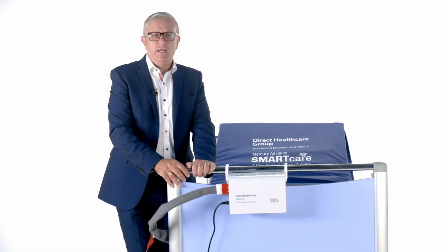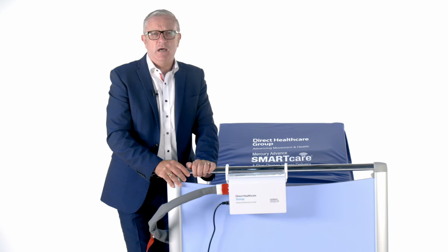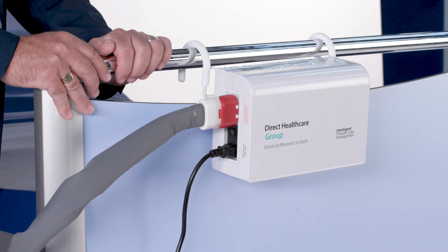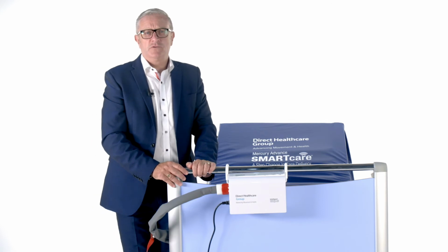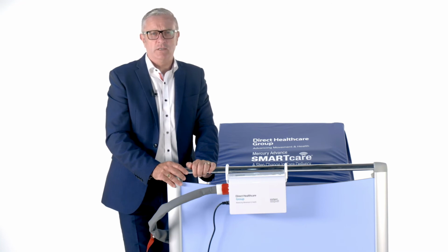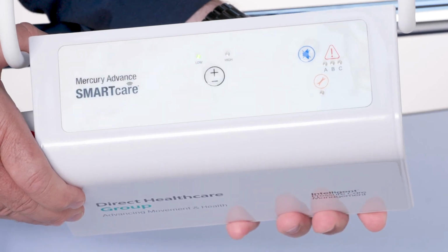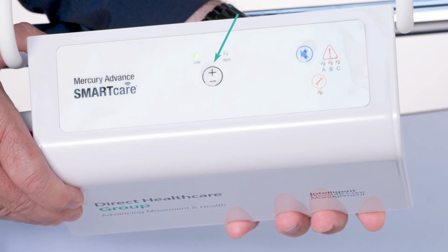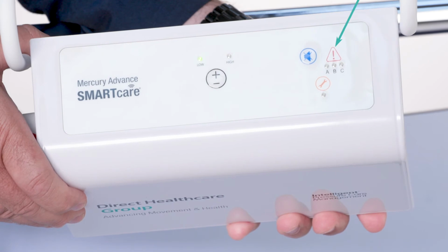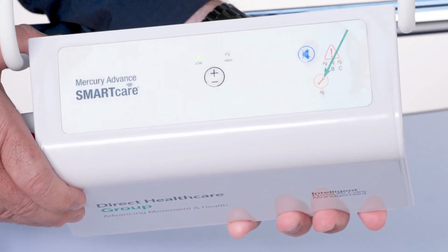The pump will bleep, the top panel will light and high-low will flash to indicate that the pump is initializing to the user on the mattress. Once the mattress has initialized, the high-low lights will stop flashing and the pump will automatically default to the low setting. Looking in detail at the pump, you will see that the top panel has a high-low function, mute function, visual warning indicator and service indicator.